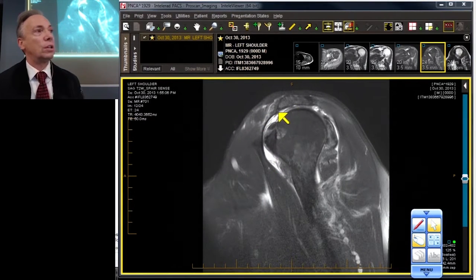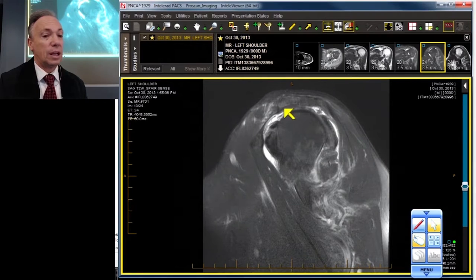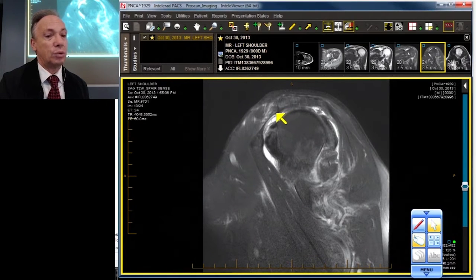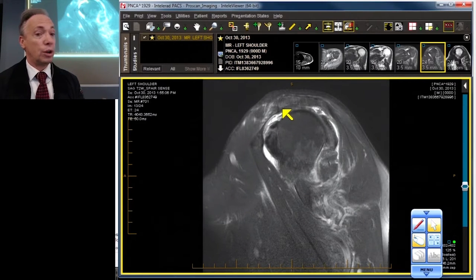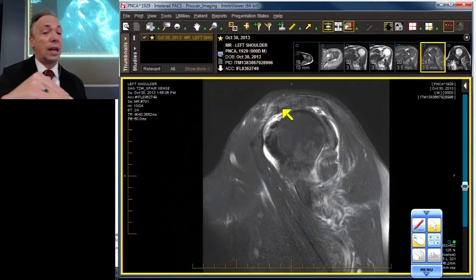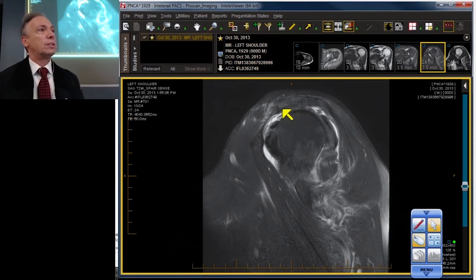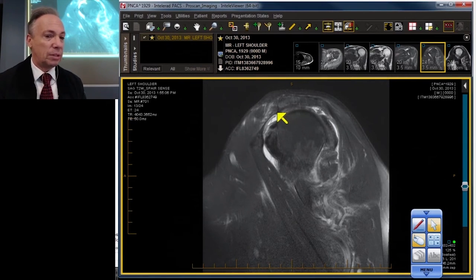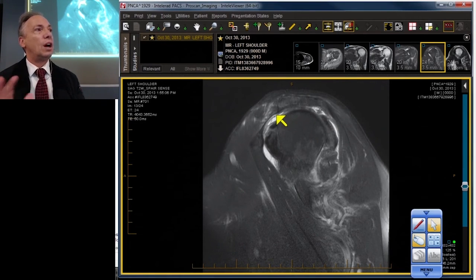We're especially interested in whether the acromion has a hook or a spur associated with it. In the sagittal projection it often looks like it has a little snout, and that snout is where the coracoacromial ligament attaches. So you have a fat acromion with a snout or spur; if it's down-sloping sagittally, and in the coronal projection you have a keel-like or telephone receiver acromion, and you also have a thick coracoacromial ligament — all of those components are part of the analysis of impingement syndrome and contributors to rotator cuff pathology.